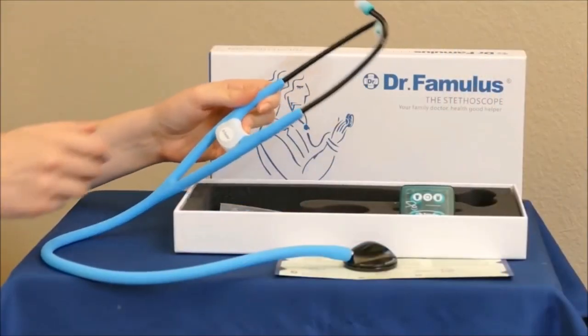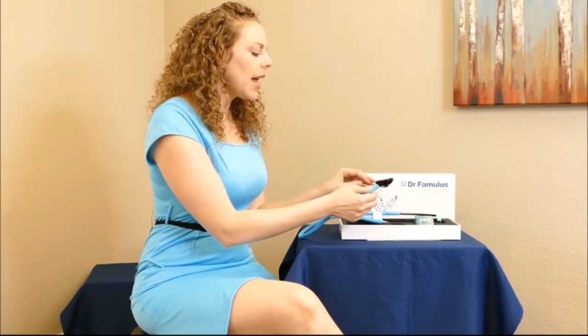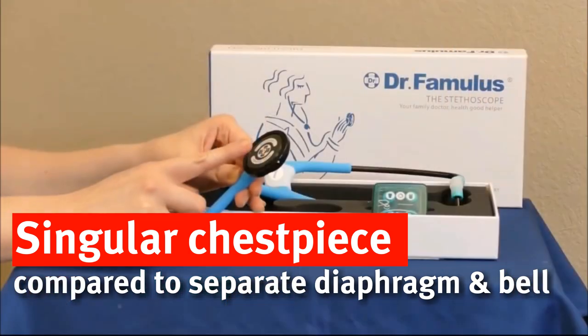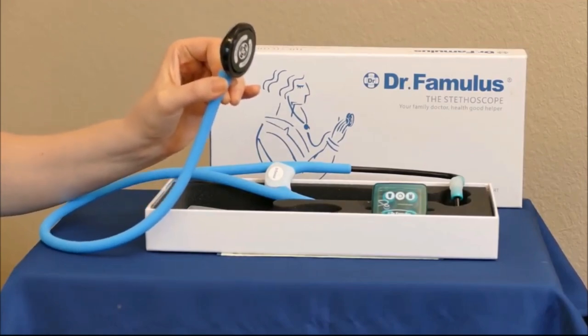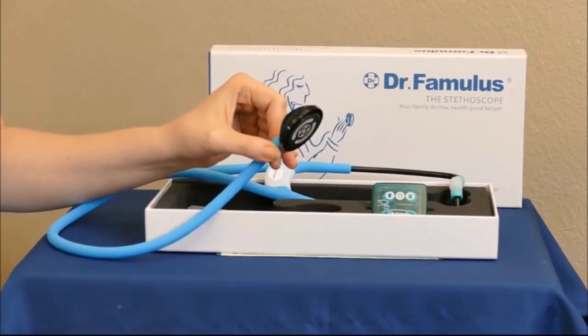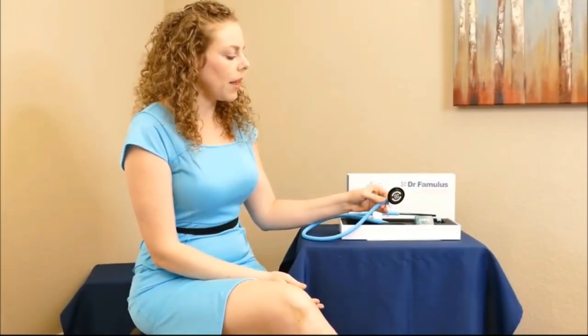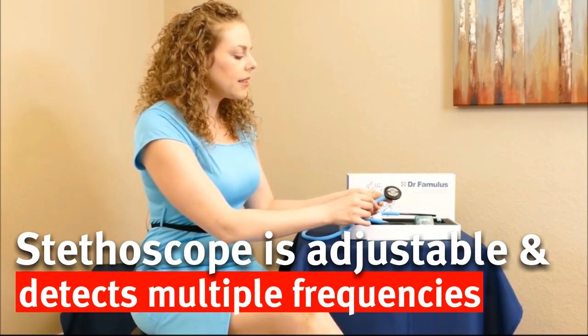Hey, it's Karina, your virtual health coach, and in this video I'm going to be doing a review of this stethoscope, Dr. Famulus. One of the things that sets this stethoscope apart from others is that it has this single chest piece — typically there's a diaphragm and bell part that you apply to the person's skin, whether you're listening for their heartbeat or breathing, but this one has combined both pieces into just one chest piece.